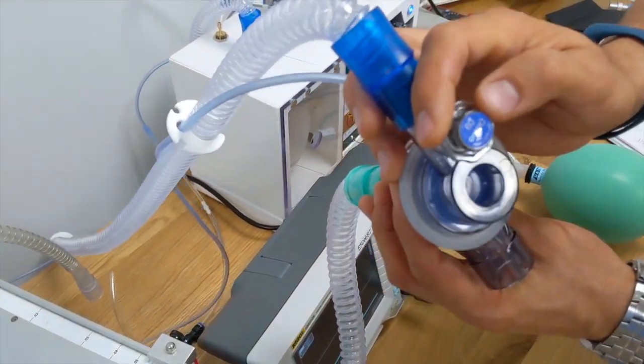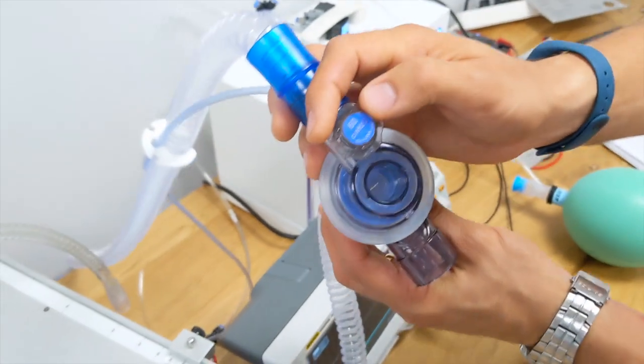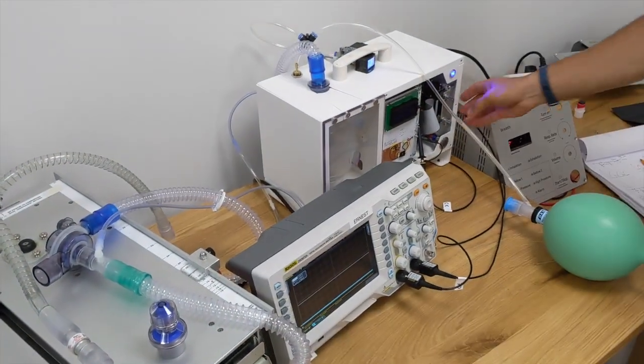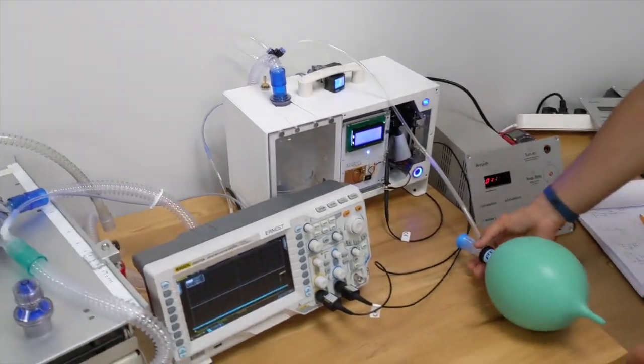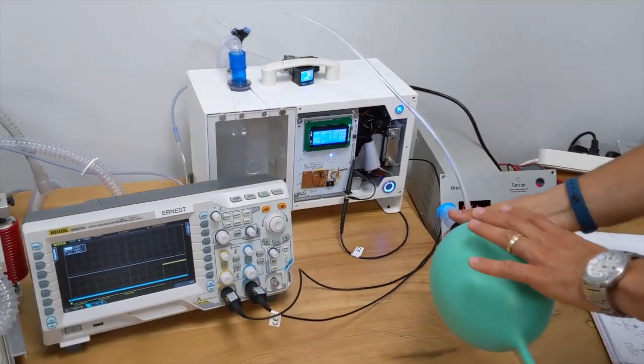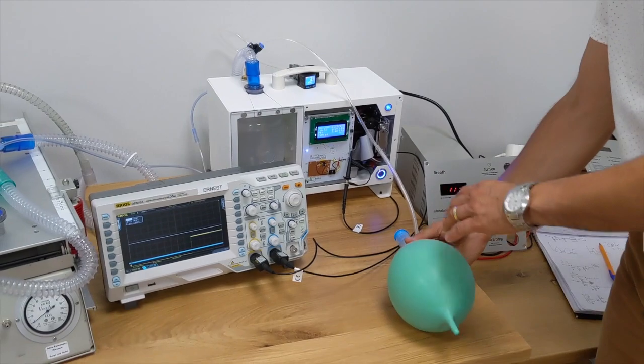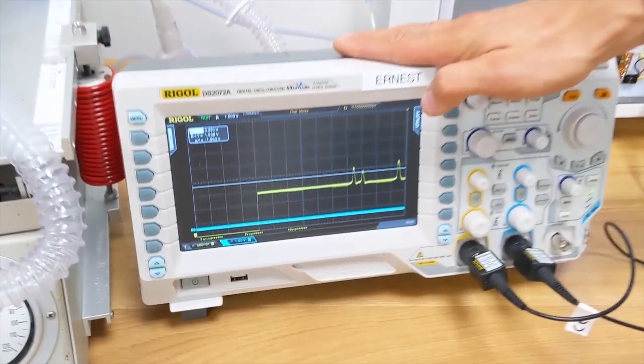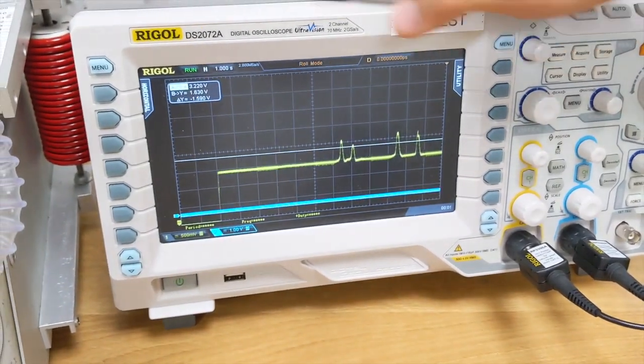And here is the mechanical maximum pressure valve with value 60. And now we have the testing of the maximum pressure. Here is the constant pressure. And by squeezing the bag, the quick impulses, you can see that it's shown by the oscilloscope.